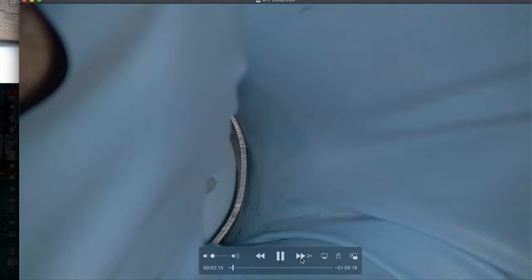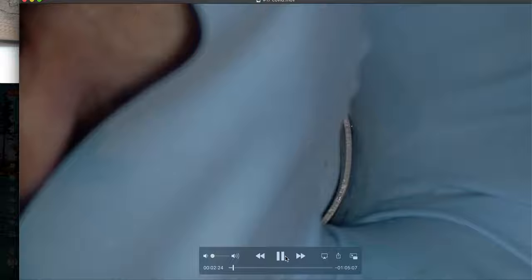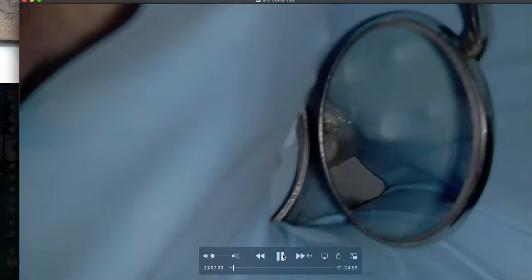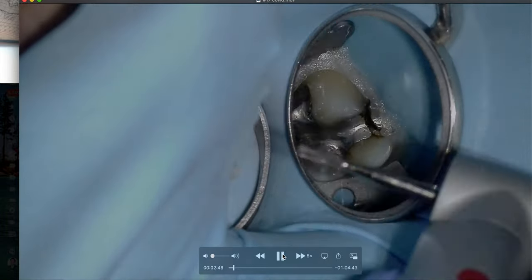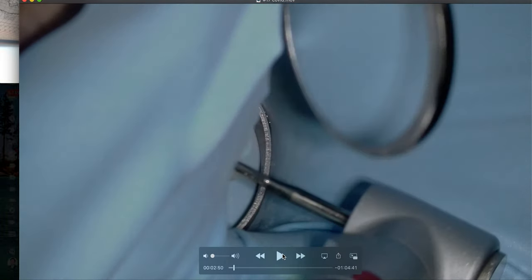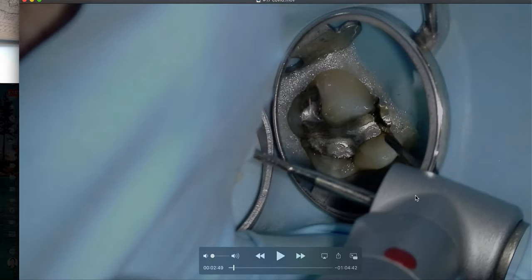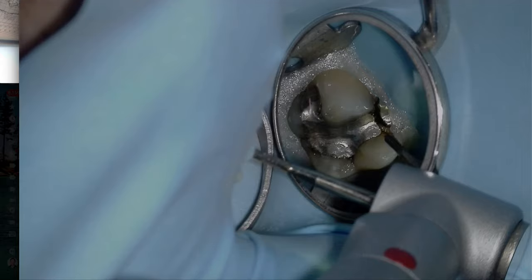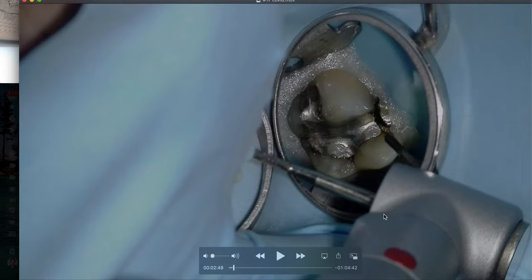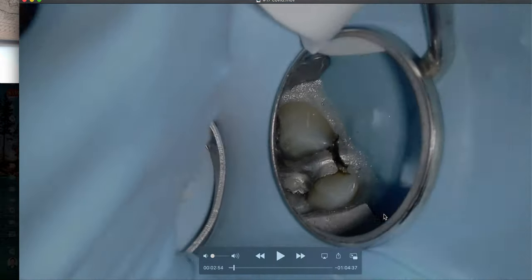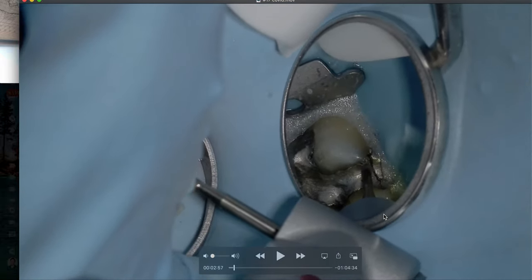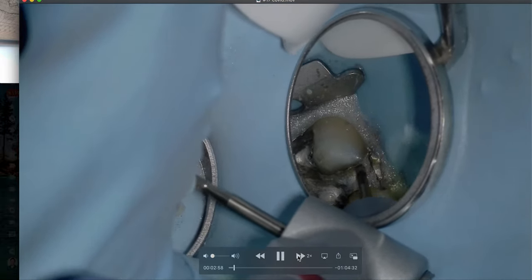So let's go ahead here. We are now going to remove the restoration and get in, create our access. There we go. We're just taking another look. So there's our 557 long shank. So it's a long shank and we use a long burr so we can keep the head of the handpiece out of our operating field. This is an electric handpiece and we're able to control the RPM. So that's super helpful. We're down to 40,000 RPM and we're just going to go and remove that restoration.